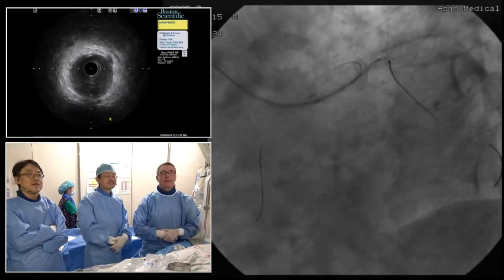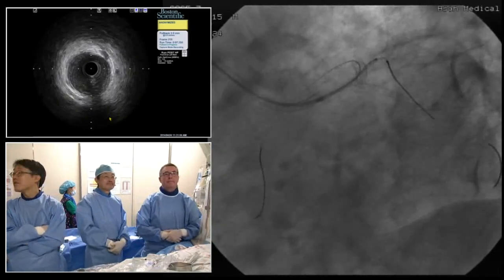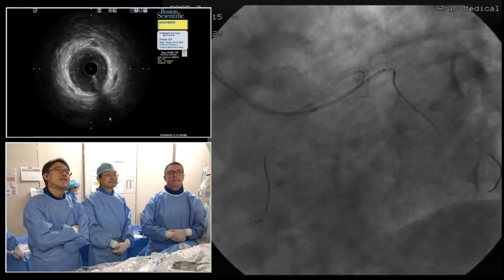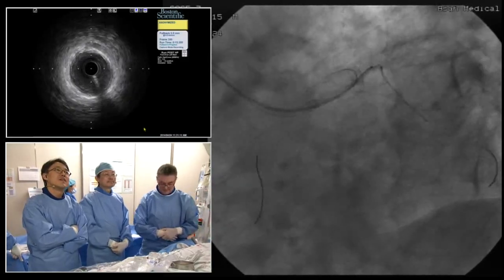IVUS before we leave. Yeah, right there. I mean, the IVUS is right across, so maybe we can look at it right now. And then we'll find out. And then we'll go to Alan. I'm sorry, I have a question, Dr. Yang, to Dr. Yang. Yes?